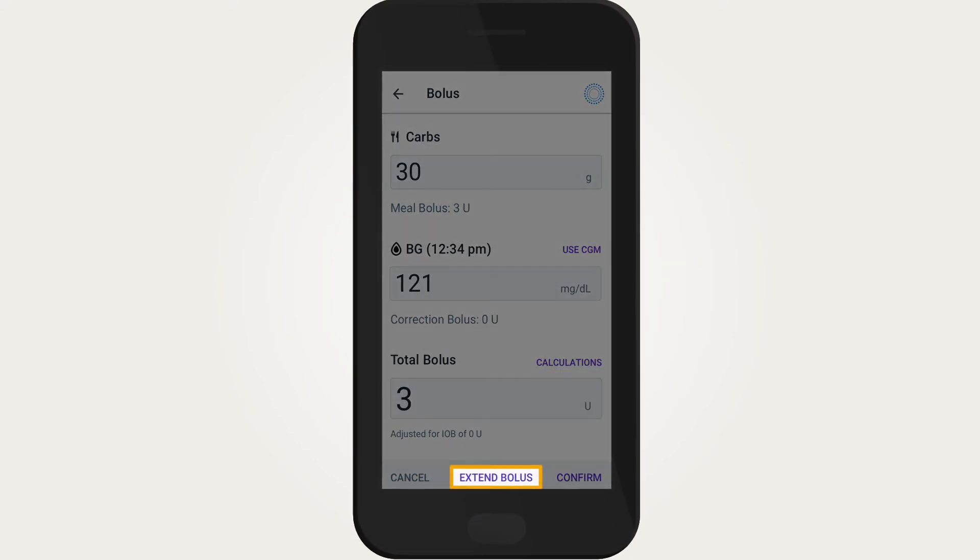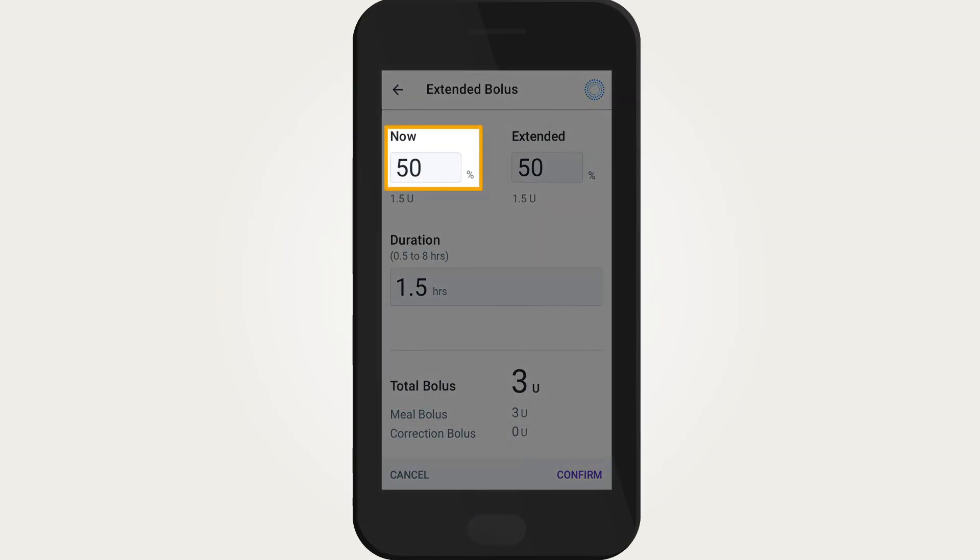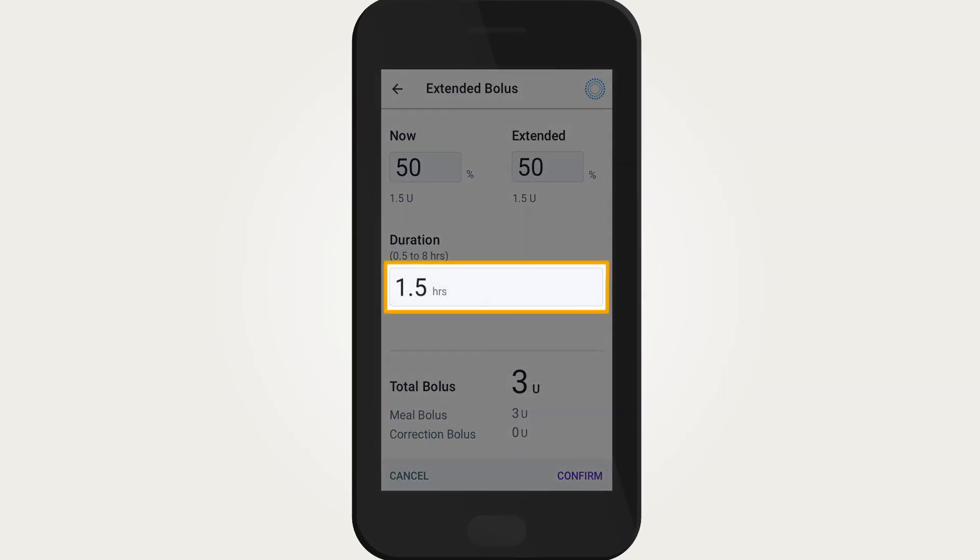Then tap Extend Bolus. Tap the Now field and enter the percentage of bolus to be delivered immediately. Tap the Duration field and enter the duration for the extended portion of the bolus.